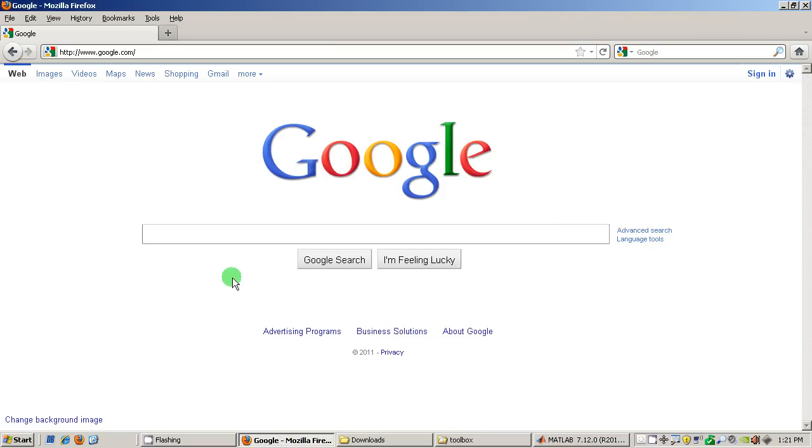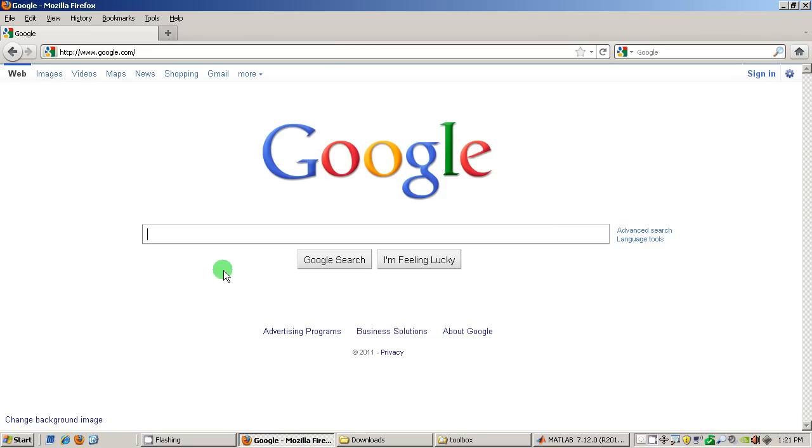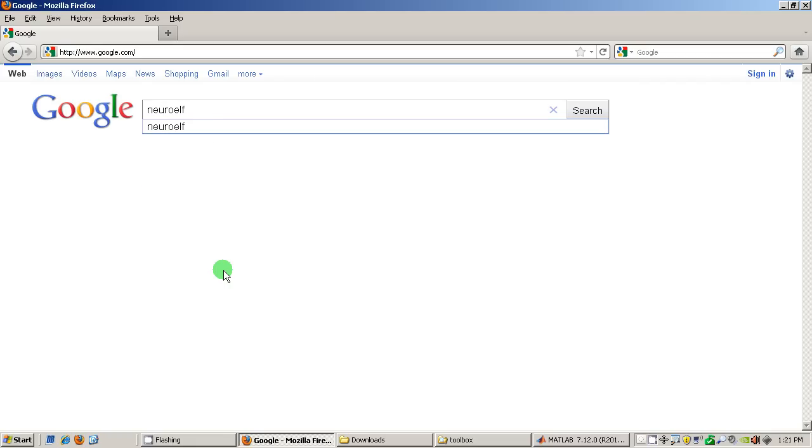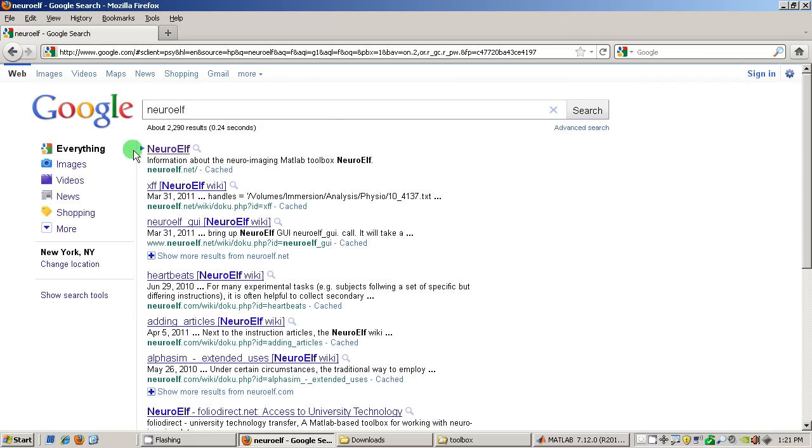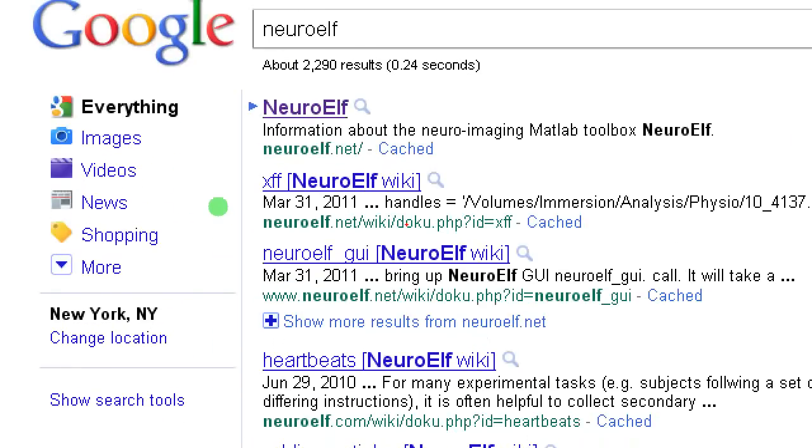First of all I'm opening a web browser, picking my favorite search engine, entering NeuroElf which is one word into the search box which brings up the very first link to the website NeuroElf.net.